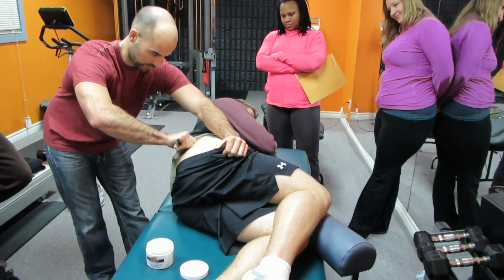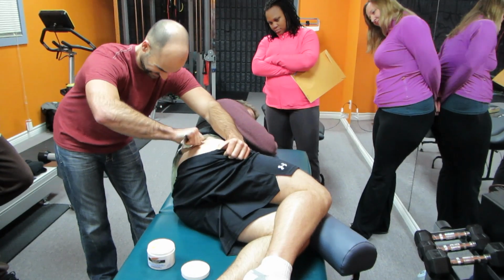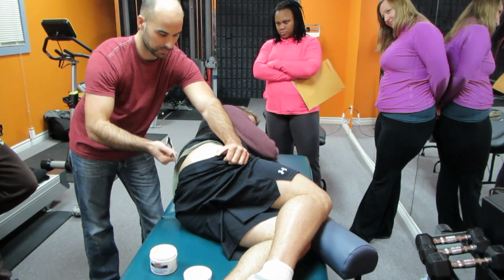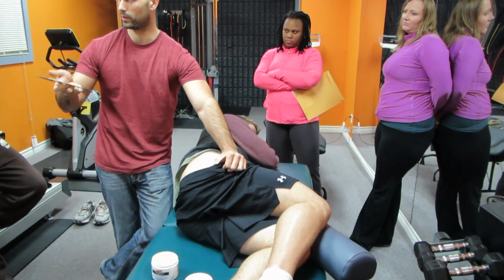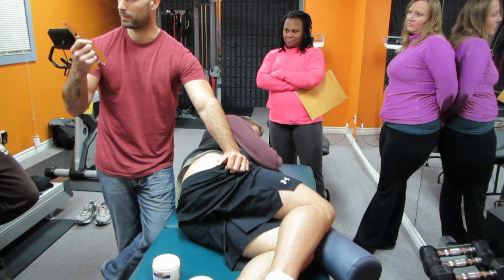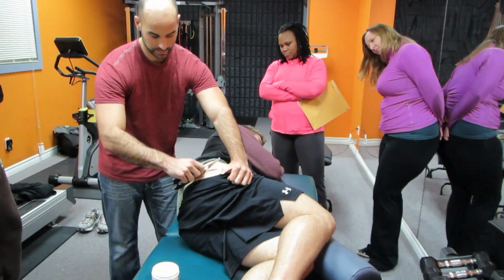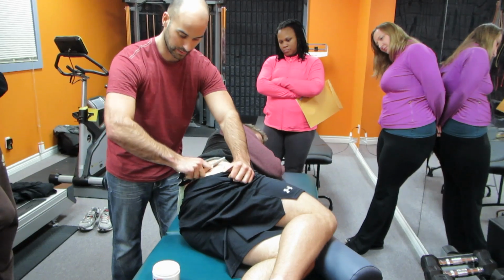We're just going to follow the way that glute attaches in there. So you do have to put a little bit more pressure in with this, but as I was telling some of you before, we don't really have to change the grip at all. We can keep a loose grip on the tool. As soon as you start gripping this tool super tight, we're not going to get that same feedback through the tool, and we're not going to feel the restrictions underneath. So if we keep a nice loose grip, the handle's there, we can put a little more pressure down, and it can sink in a little bit more.